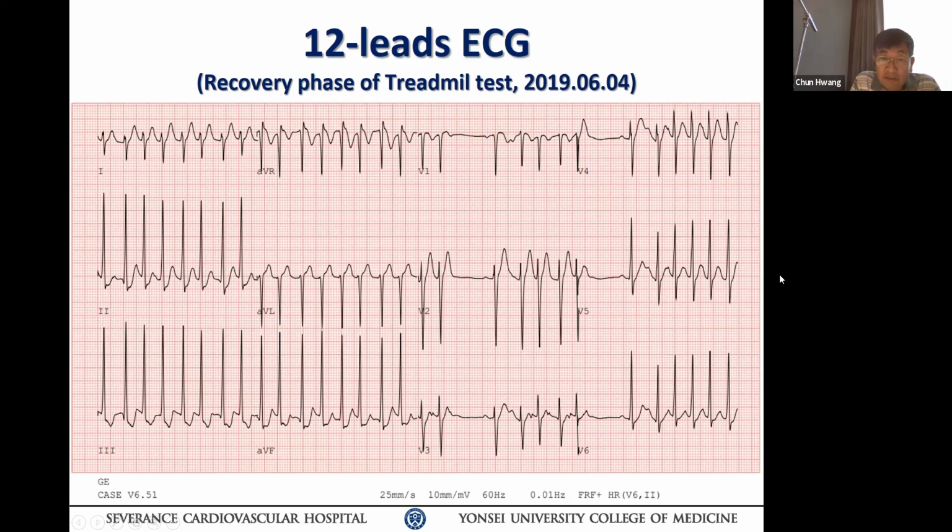Looking at V3, the P wave is initially positive. Then what happened with the second beat? Is that a sinus rhythm too, or not? Look at V3, the tracing in the middle. Yes, there. Then the tachycardia, but the tachycardia is irregular. Is this normal in SVT? Let's see if you have a single pathway. Okay? How do you explain this? You've got to explain everything you see in the EKG. You can't just assume what it is.